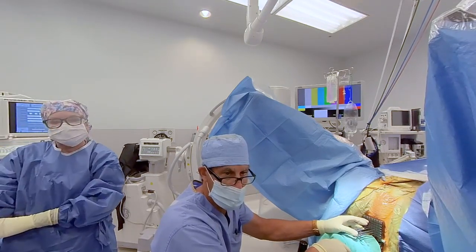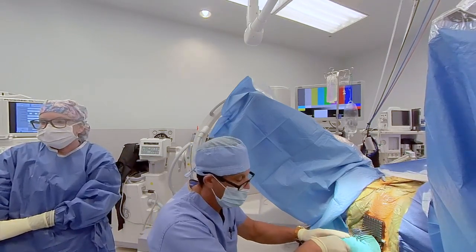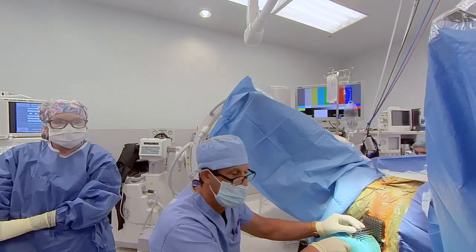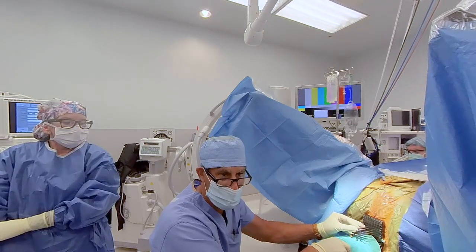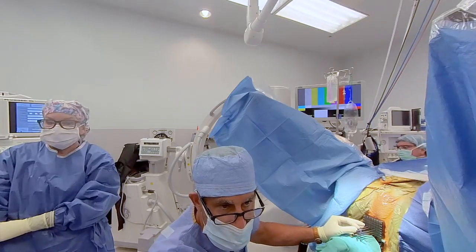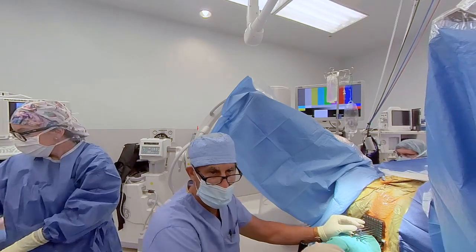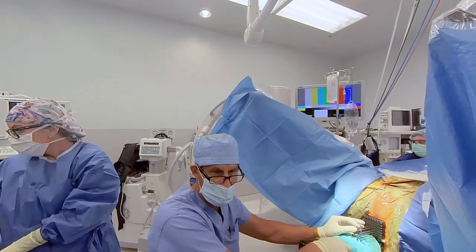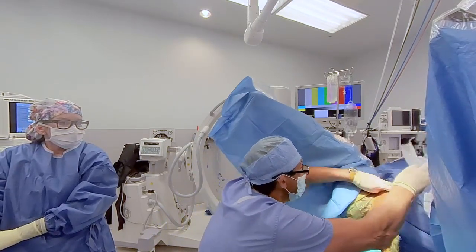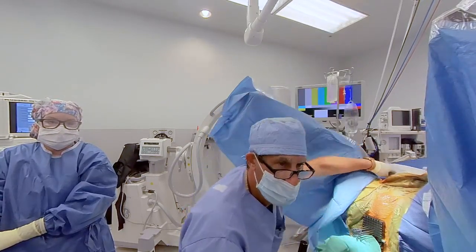It looks like you're pushing all your needles all the way to the base right now. Yeah, so using the microtouch, which has a cradle, allows me to maneuver the cradle from right to left to look at the needle tips and to push it right below where the bladder neck is. So if you figure the edge of the balloon is here, the bladder neck is probably right below it, and so the prostate is really starting almost a centimeter below the balloon. We can tug on the balloon to make sure that it's at the base, and that's exactly where we want it.